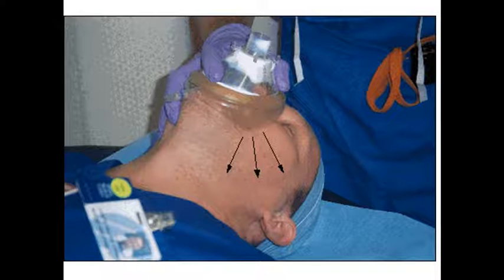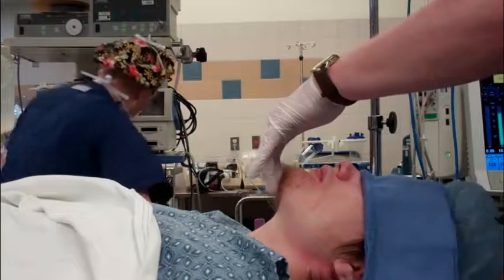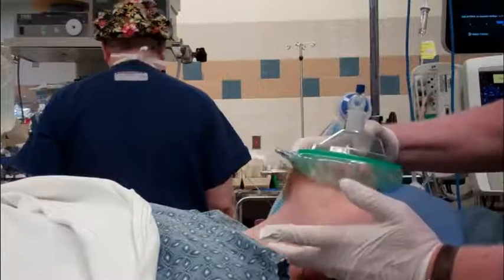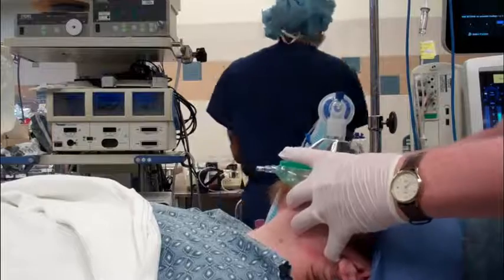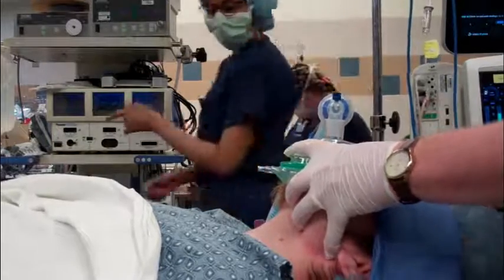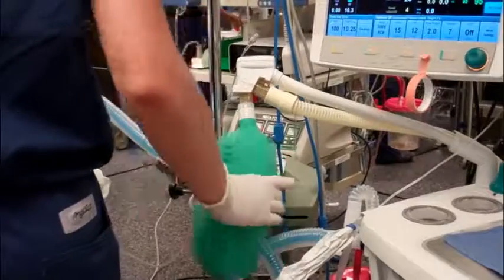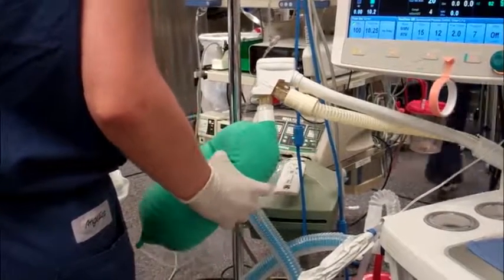We all do. When performing mask ventilation in the OR, the first thing we do is a chin lift with a head extension. Place the face mask on the face, ring and little finger of the left hand on the vertical ramus of the mandible, the same on the other side. Thumb and index finger on the mask, forming a pneumatic seal with the patient's face. Right hand on the green reservoir bag, ventilating the patient with a nice taut bag with plenty of pressure, but not excessive pressure, in the reservoir bag.